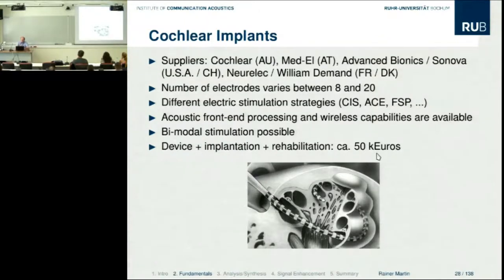And finally, it's quite expensive, an order of magnitude more than a hearing aid device. The cost to the end user, which also includes the fitting and adjustments and service, is in the range of 600 euros for a relatively simple one to, I would say, 2,000 to 2,500 euros for the high-end devices. You typically need two of them. There's still a 3 dB gain there.